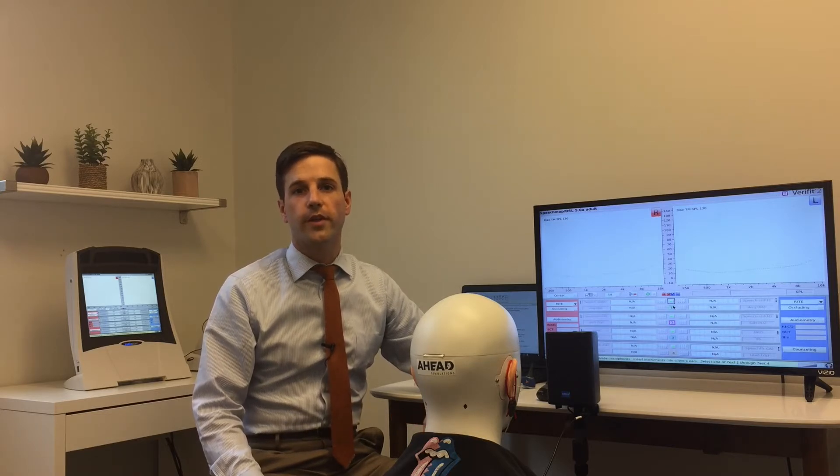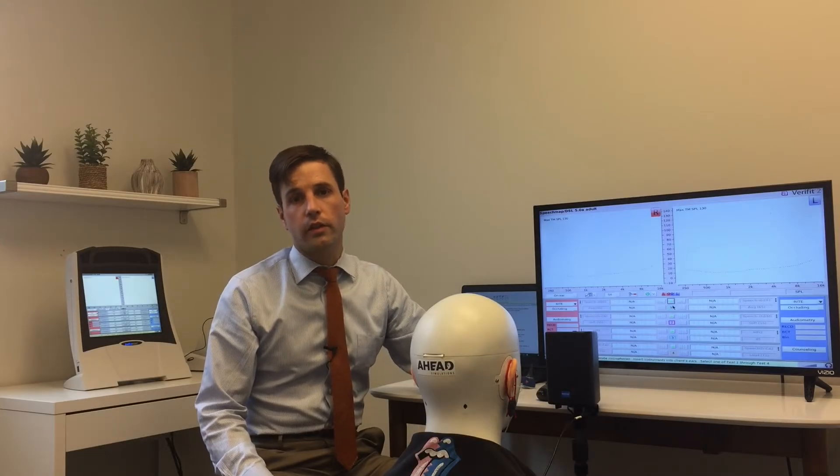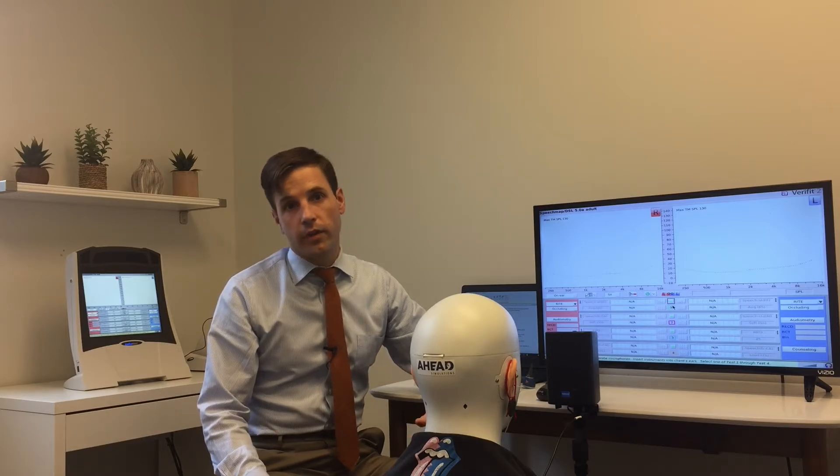Pull it up and check it out. Basically my goal when fitting hearing aids is to ensure that the client is getting an adequate improvement in audibility and I'm optimizing audibility in any way that I can. Obviously audibility isn't everything, but let's face it, it's almost everything.